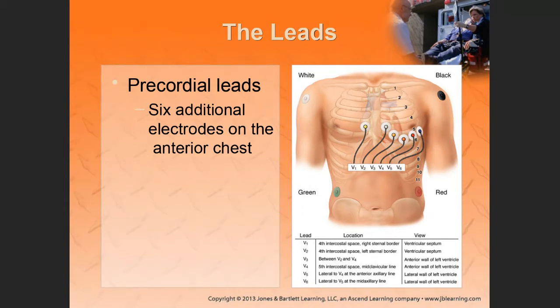That's your left side. That's the answer. If I am doing a 12 lead ECG, which leads would look at the inferior portion of the heart?